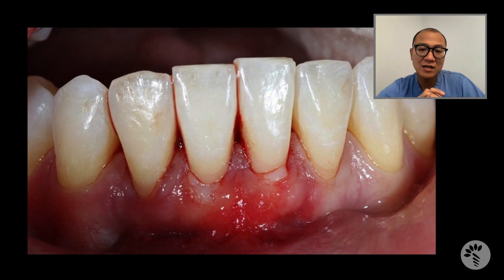You can clearly see that I stuffed the connective tissue graft really nicely — that is why the recipient area looks thicker. But at the same time, I intentionally left the epithelium portion of the graft exposed in this area. I then tugged the lip to make sure there is no movement, and finished the case by placing surgical dressing.